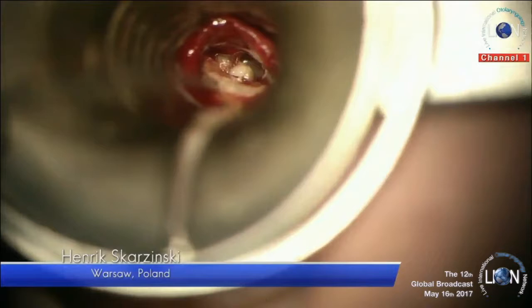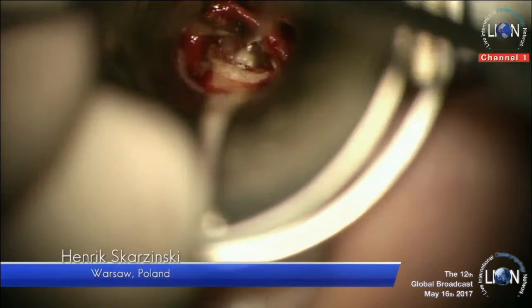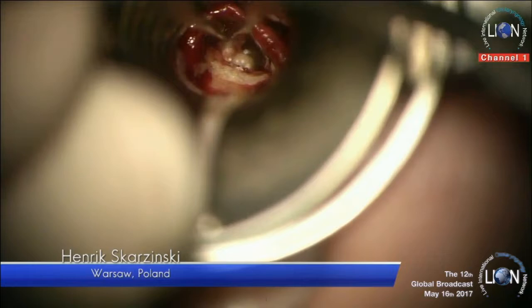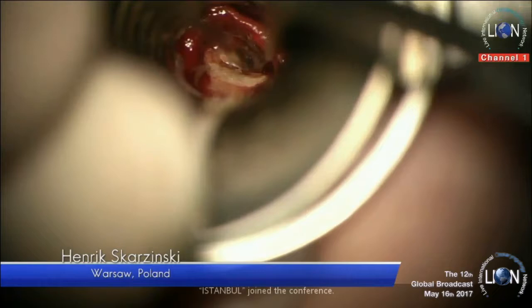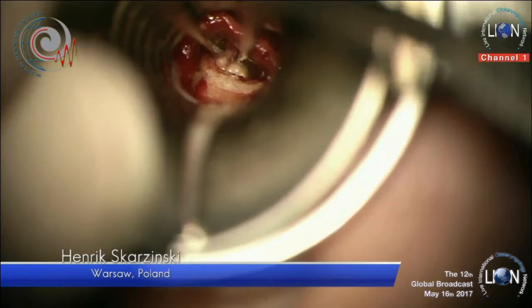Do you have any questions? When you dry it adequately, how long does it take for the cement to set? It's not about a fixed time that is recommended to dry — we dry it when we see that it's ready, and then we check how firm the movements are. If we have a little bit of bleeding like now, it takes a little bit more, it could be some minutes. If there is a very dry field with no bleeding and no fluid, it's less time.